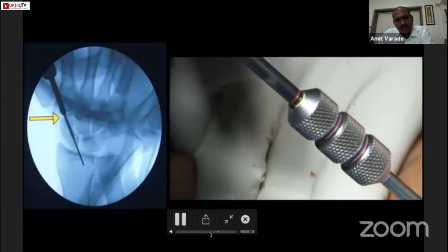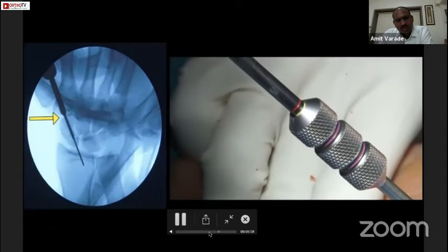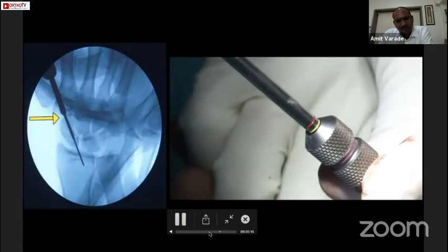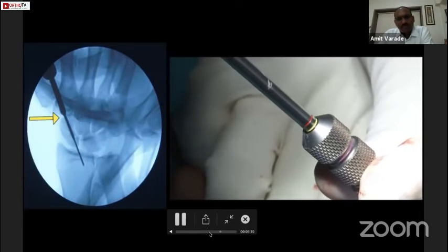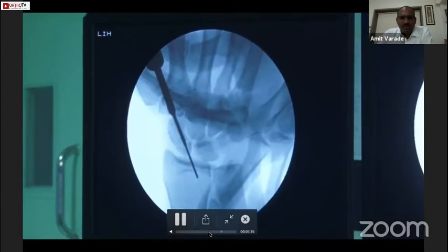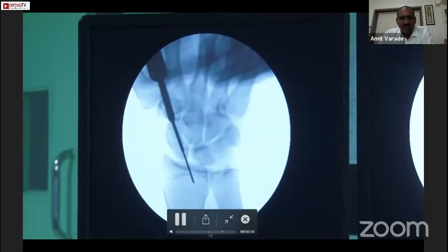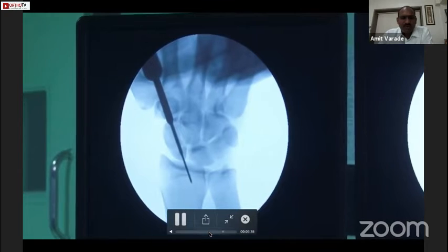Now we can see the yellow mark, which means the top of the screw has reached and is flush with the distal end of the scaphoid. As we drive the screw further inside, we can see that the fracture site is getting reduced nicely and compression is being achieved.